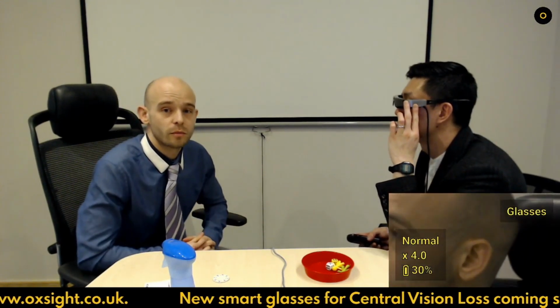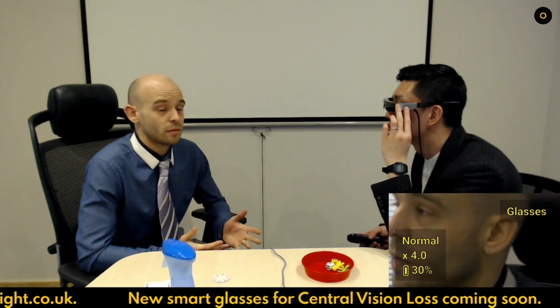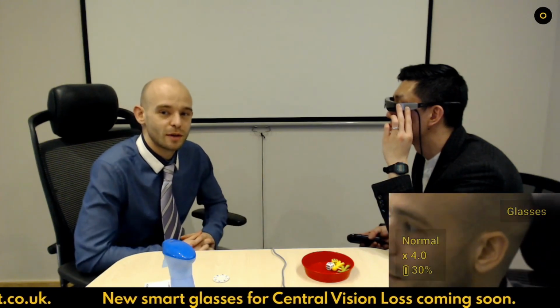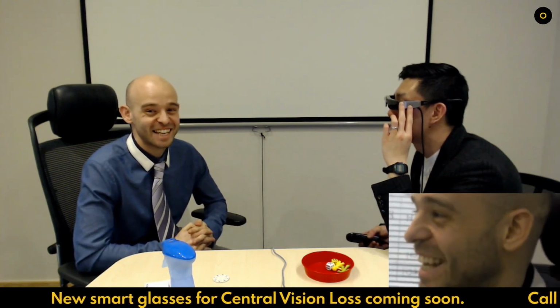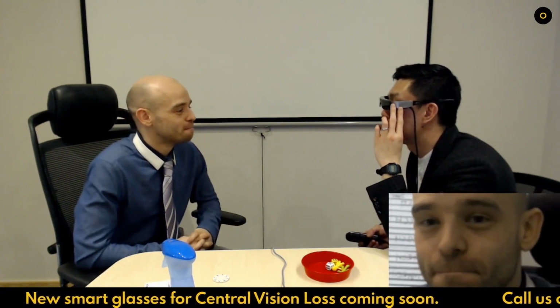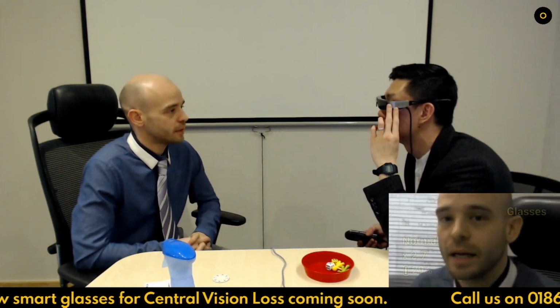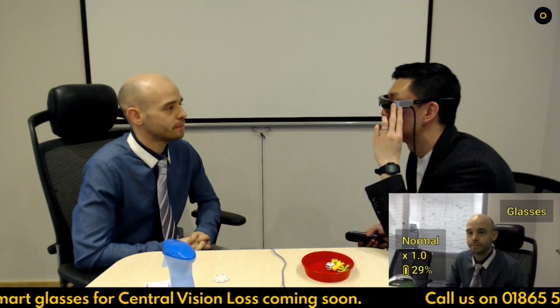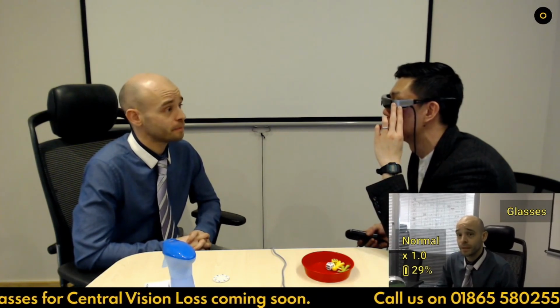People are going from maybe 5, 10, 15 degrees field of view, and they're getting 68 degrees field of view. That looks bizarre. It's so zoomed in on my face. No, as in, what you're saying is maybe they can only see this much, literally this much. Yeah. And then with this, it's basically giving them exactly that. All that. Exactly that.